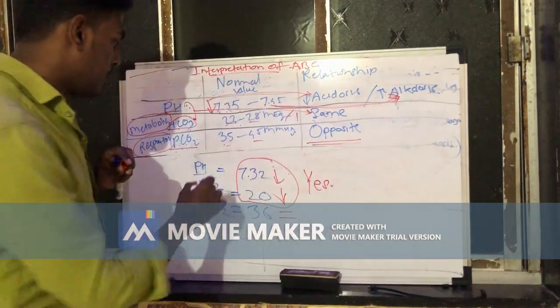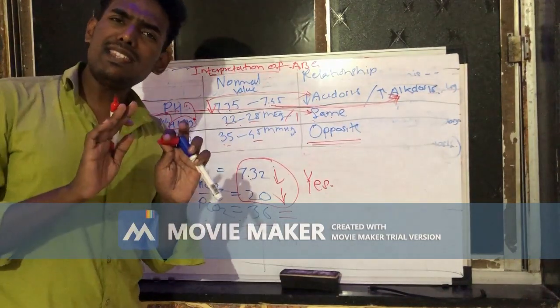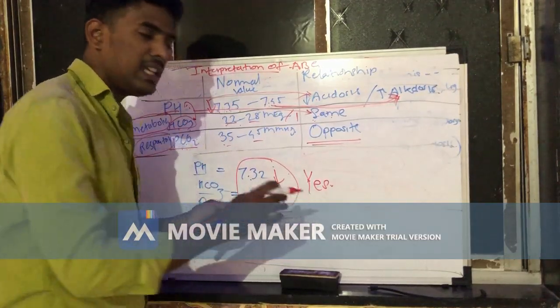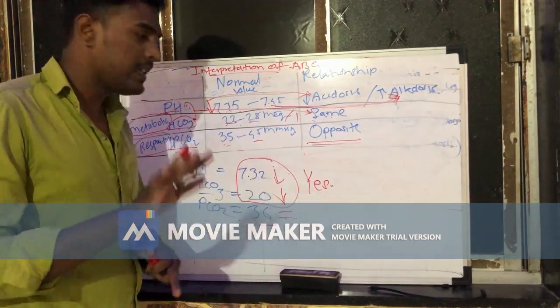Yes. So your pH and HCO3 are showing the same relation. And the PCO2 is stable. He didn't change his position, so there is no meaning in it. He is completely separate. It's not involved in any change in the pH.